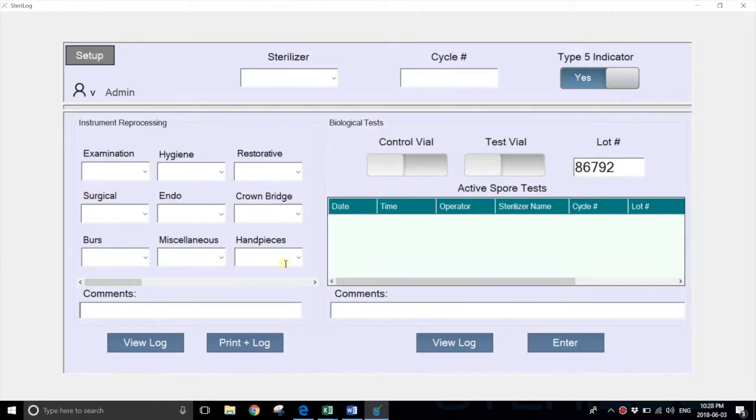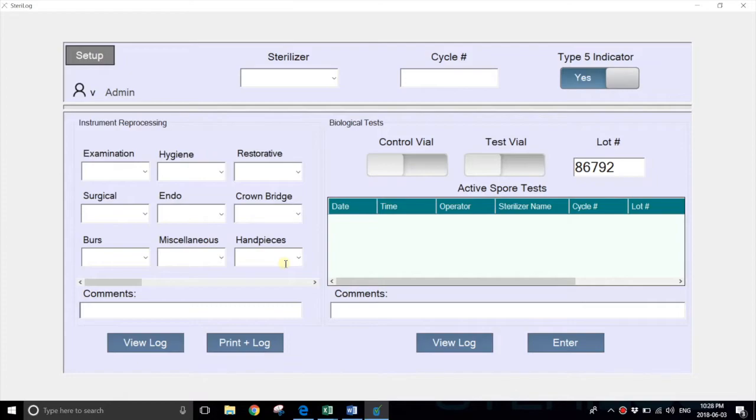Now that we've customized the system by adding sterilizer names, setting up users, and adding customized package names, we're ready to start using the system.